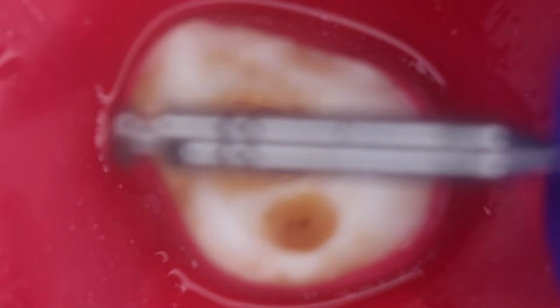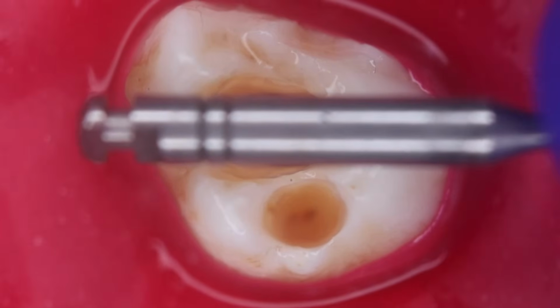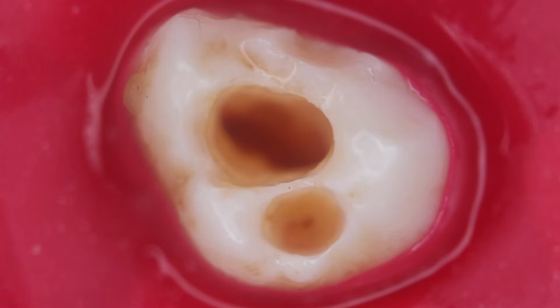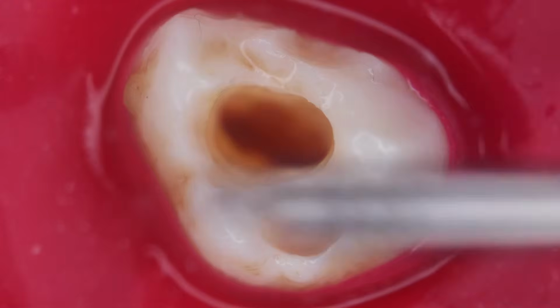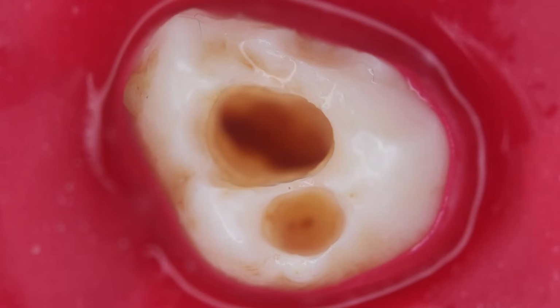The size 2 will have 2 rings, as you can see over here, and the size 3 is the next in the sequence that we are using. This size will have 3 rings to enlarge the orifices more. Hope you are able to understand what we are doing.